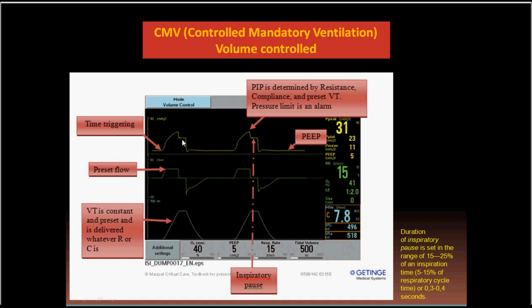It is important to keep in mind: if you are using IE ratio, the inspiratory pause will be a percent of the inspiratory time. If you are using time instead of IE ratio, in this case, this inspiratory pause will be a time, 0.3 or 0.4 seconds.